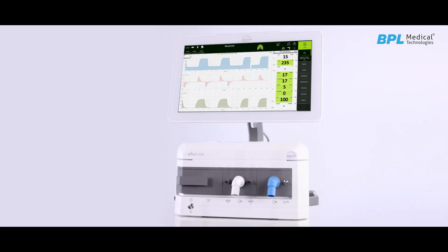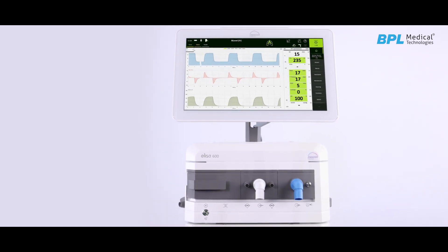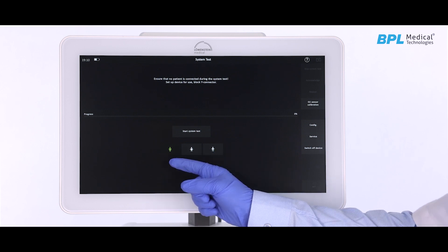As a universal ventilator, ELISA 600 is used for invasive, non-invasive and oxygen therapy that can support neonatal, pediatric and adult patient categories.